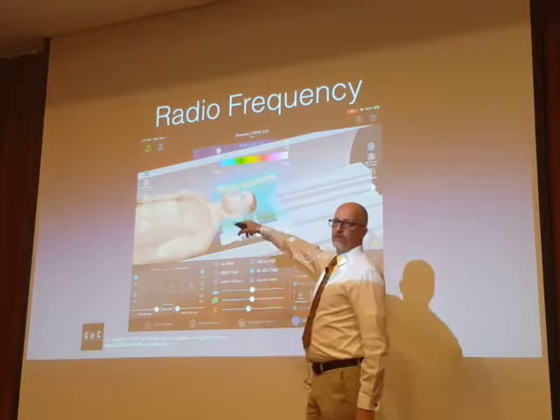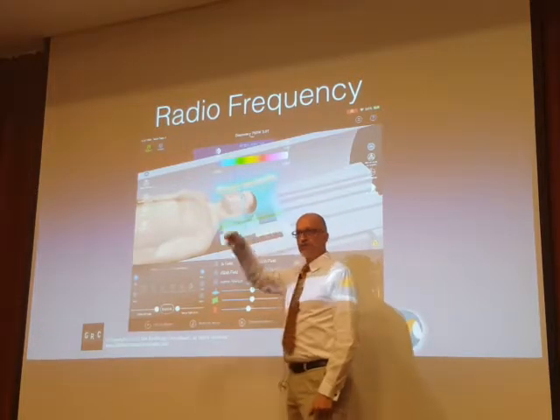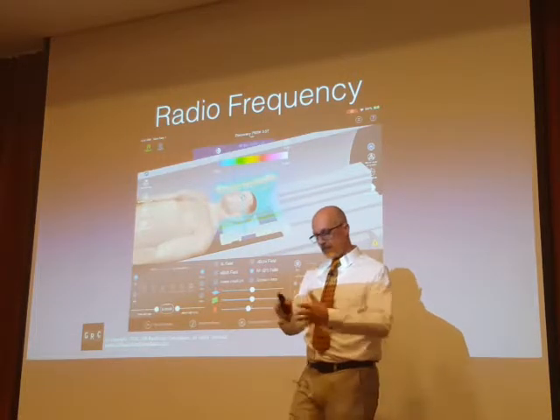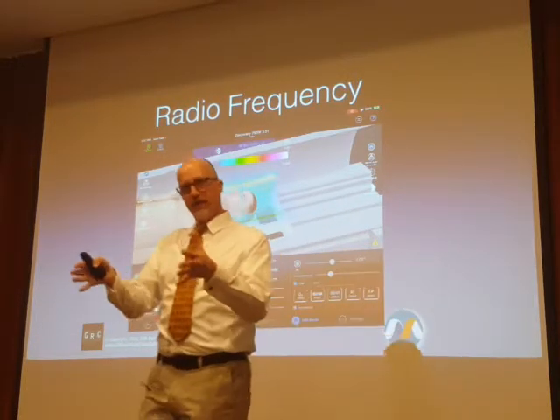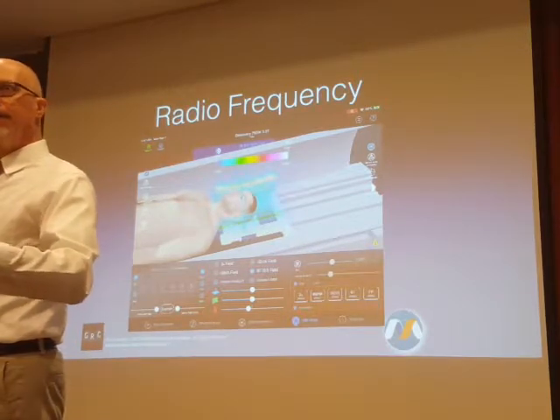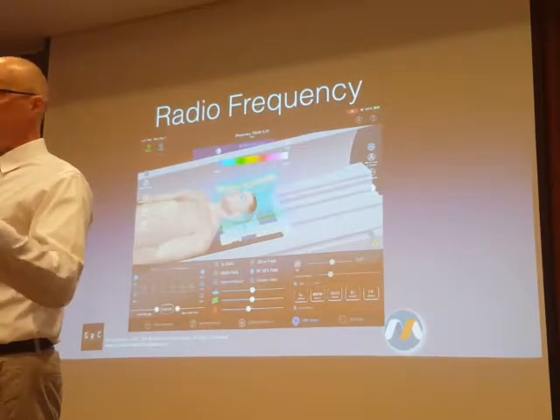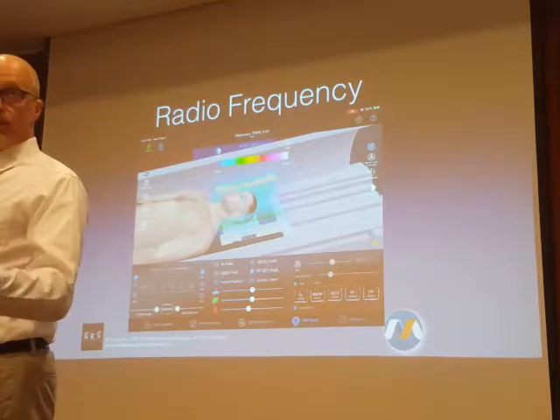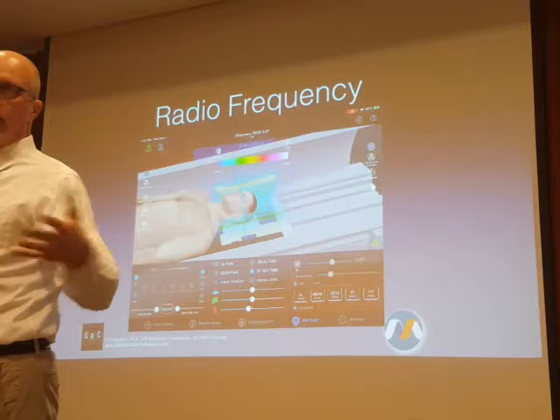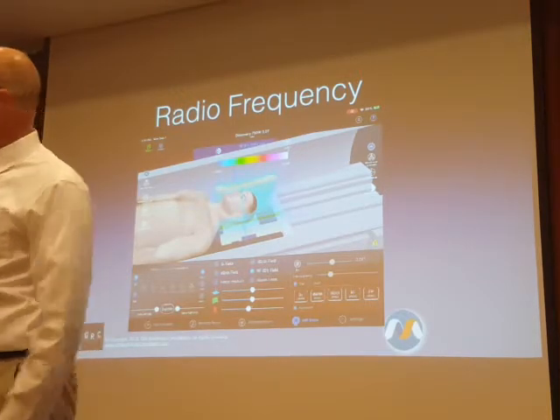In most cylindrical coils, like a transmit-receive head or transmit-receive knee, you can look at the coil itself, and where the cylinder ends, maybe a centimeter beyond that, the tissues get radio frequency energy in some meaningful quantity, but you go much beyond that, and they don't.